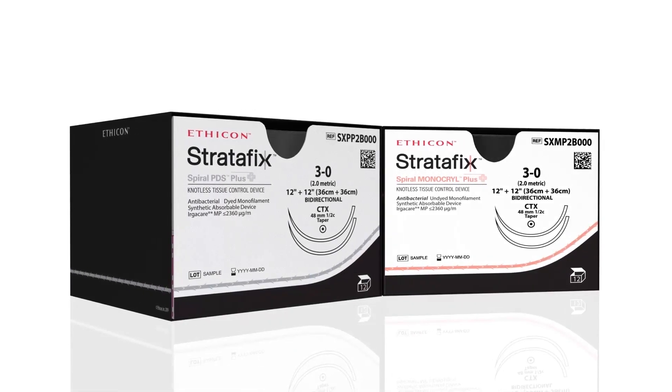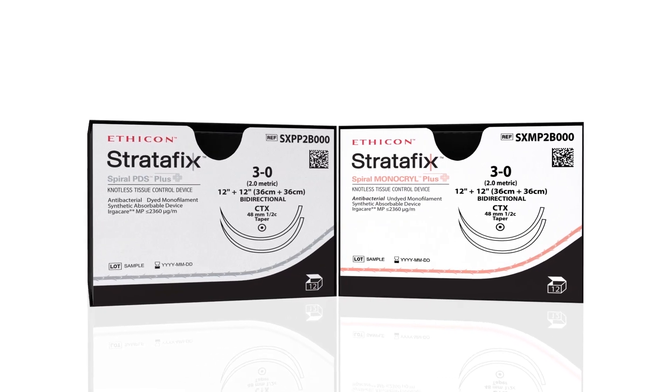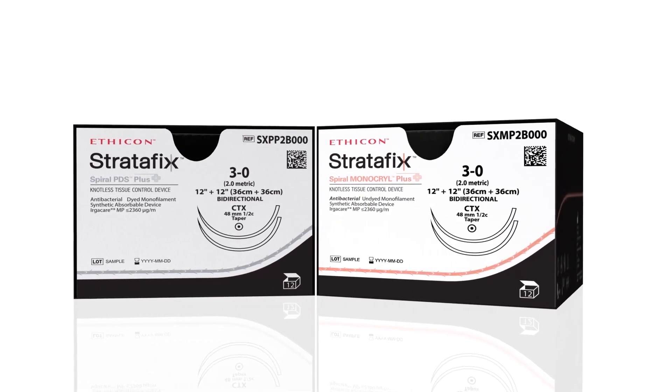Bidirectional Stratafix devices. Now with PLUS antibacterial technology. Only from Ethicon.